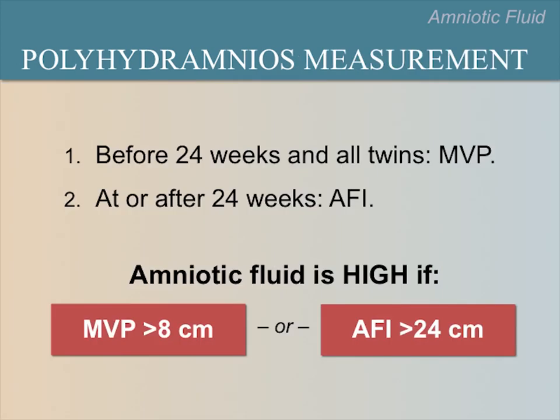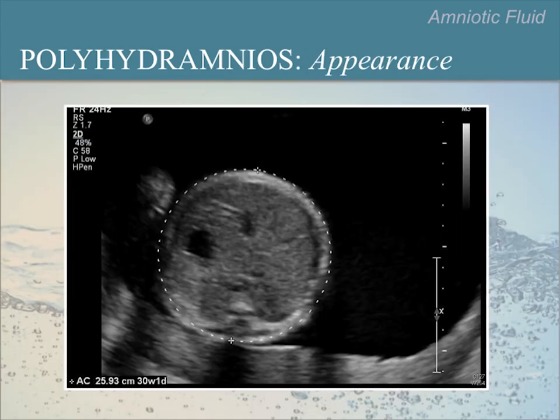This is a transverse view of the fetal abdomen with excess amniotic fluid. Where do you see the excess fluid? Please pause the video now to encourage responses from within the group. Here you can see the umbilical cord inserting into the fetal abdomen. Notice again the excess fluid in this image and how the fetus appears to be floating.